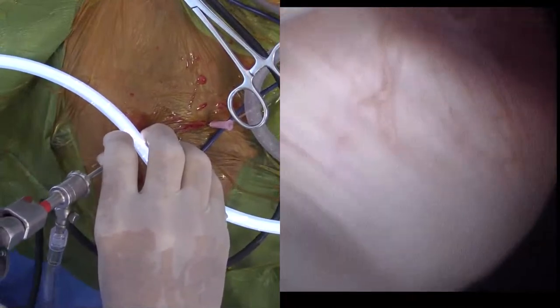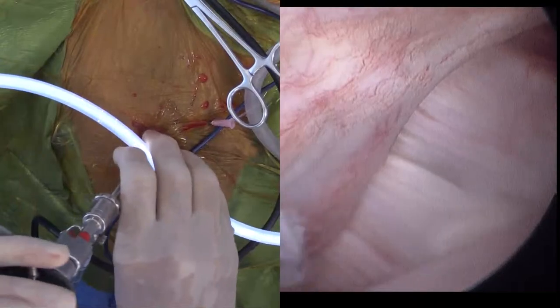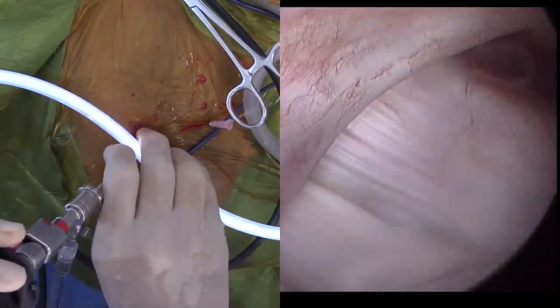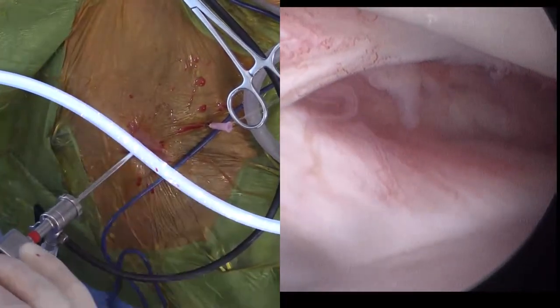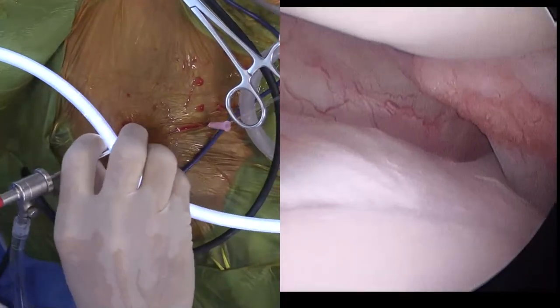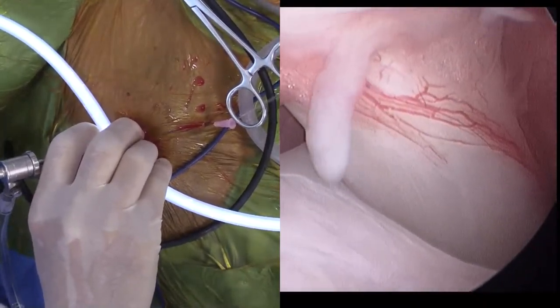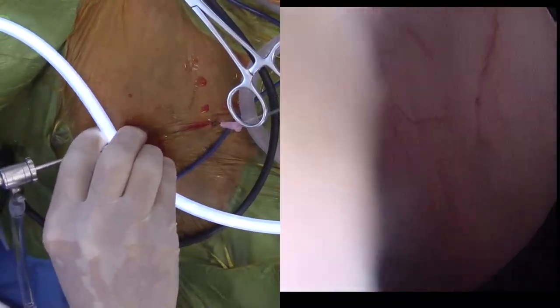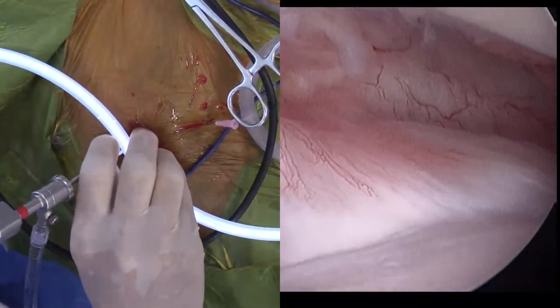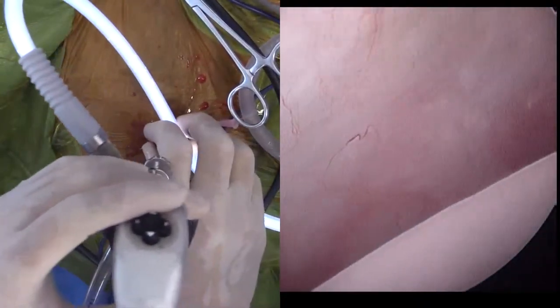That's our medial collateral ligament there, and that's our subscapularis tendon there. There's a little bit of synovitis there, a little bit of fraying on the collateral ligament. We'll come down and look at the biceps tendon — that's the biceps tendon there. There was some calcification on the biceps tendon on the preoperative radiographs. I'm looking down the biceps bursa here. Back to the collateral ligament — that's the humeral head right there.